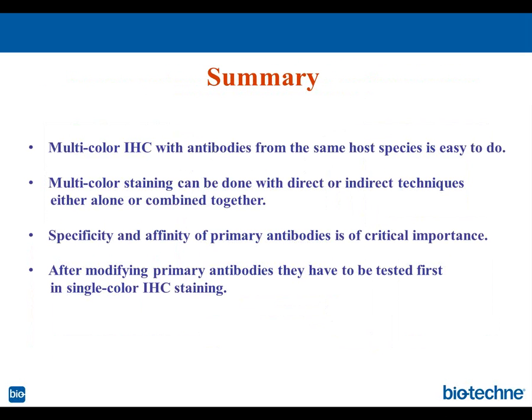So yes, the answer is yes, you can use it when you use your primary antibodies on the same, and when you have to use secondary antibodies on the same host, on the same species where these antibodies were raised in.